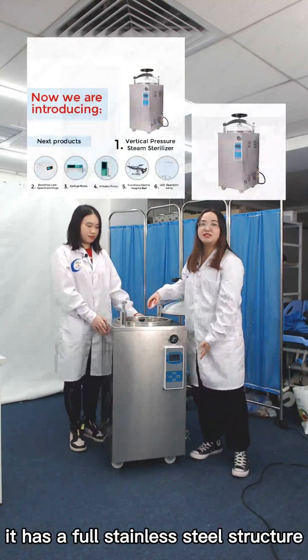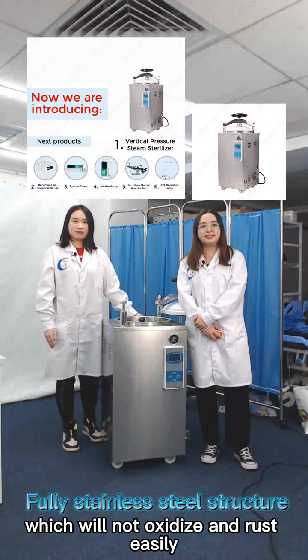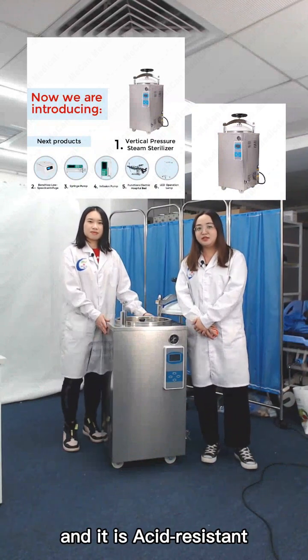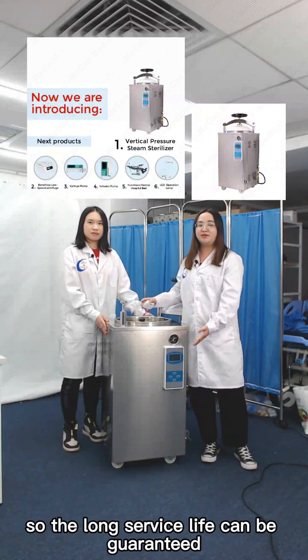As you can see, it has a full stainless steel structure which will not oxidize or rust easily. It is acid-resistant, alkali-resistant, and corrosion-resistant, so a long service life can be guaranteed.